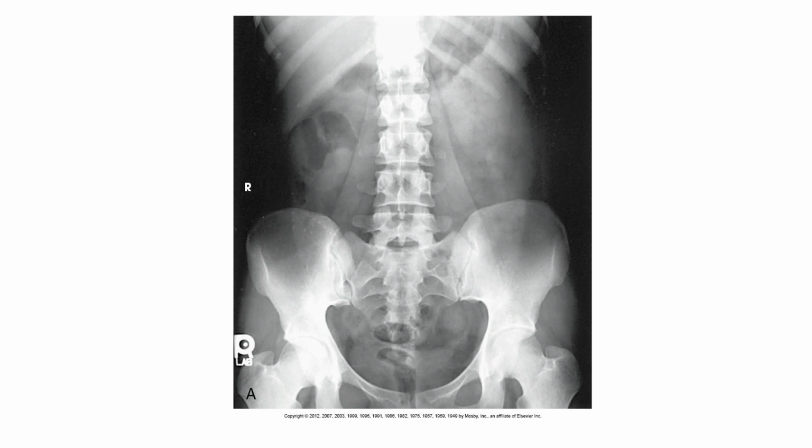Now, I like to call that the angry emu sign, and I'll show you that coming up. But that is a sign that your lumbar spine is not rotated. If those spinous processes are centered, that is the vertical dashed line of bone is centered on the ice cube shapes, well, then your lumbar spine is not rotated. Okay.